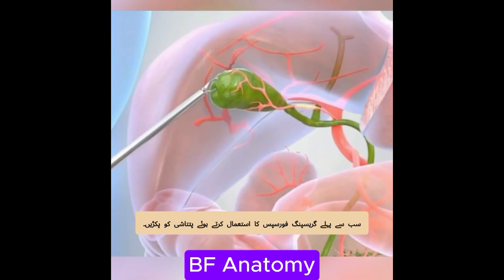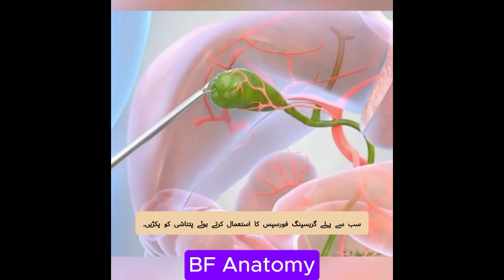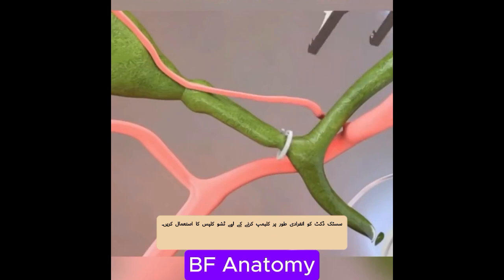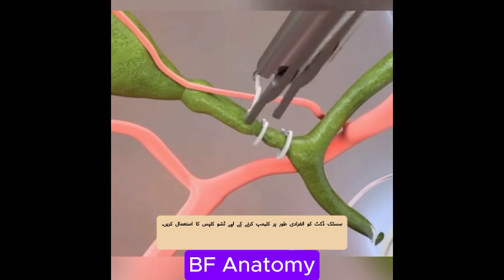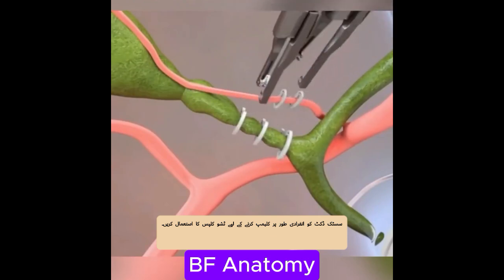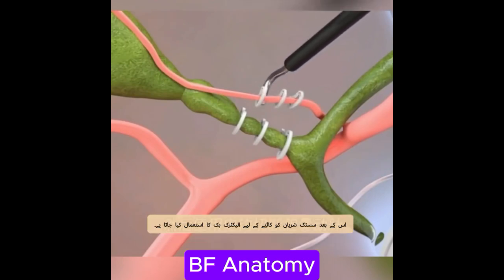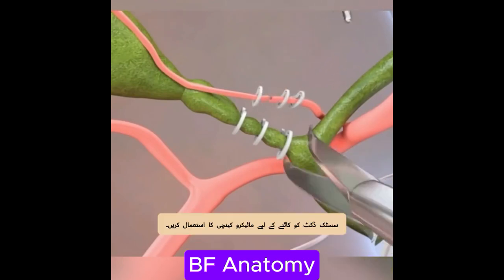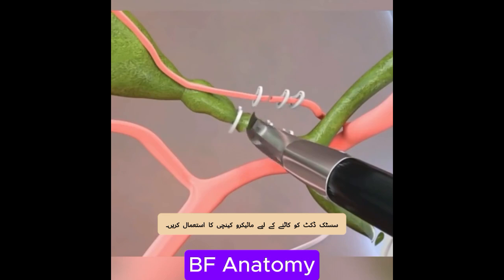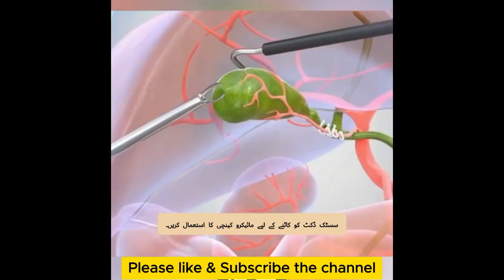The gallbladder is grasped, exposing the cystic artery and duct. Clips are applied to the cystic duct and gallbladder artery. Electrocautery is used to cut the gallbladder artery, and the cystic duct is cut with scissors. The gallbladder is then freed using cautery.